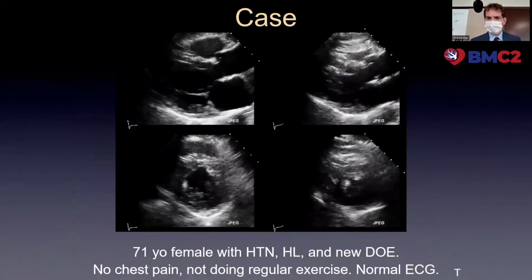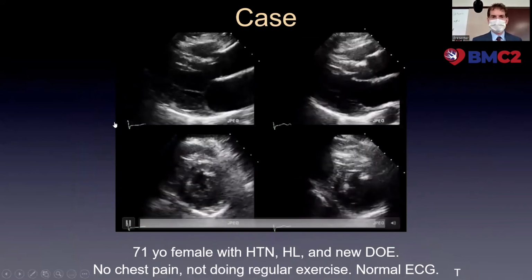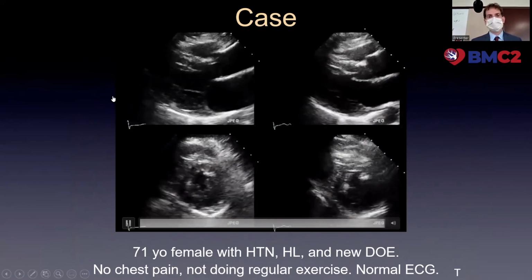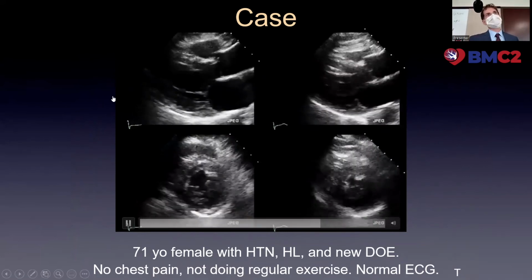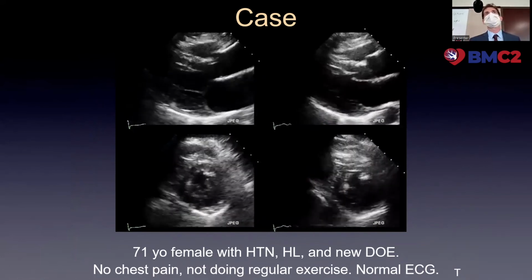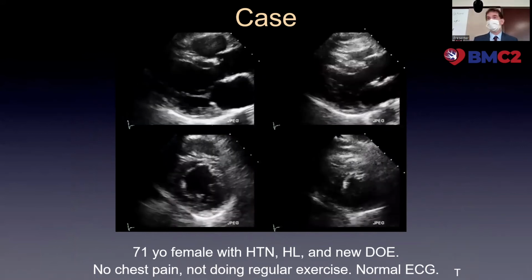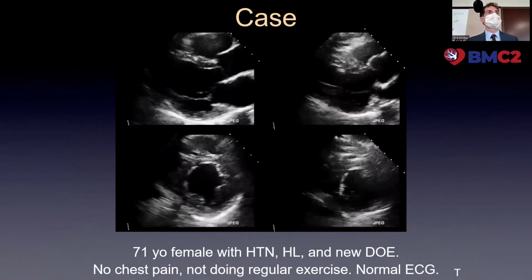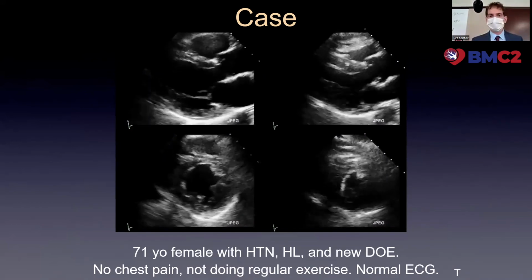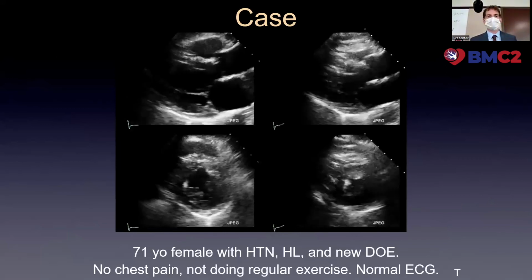Here's a stress echo. So I spend a lot of my time reading echoes. These are some different views of the heart. And what we do in a stress echo is you basically take some images of the heart at rest, run somebody on the treadmill really hard, and then they jump off and you take quick pictures before the heart slows down. Or you can give them dobutamine and have the heart rate go up and then image the heart at peak dobutamine, which makes the heart go fast and beat really vigorously. And you're looking for wall motion abnormalities that happen with stress.